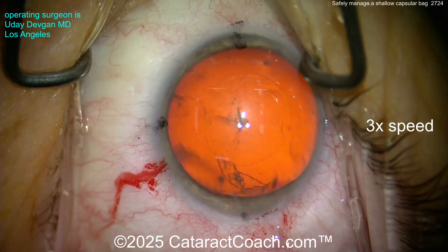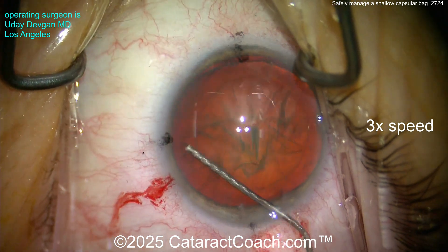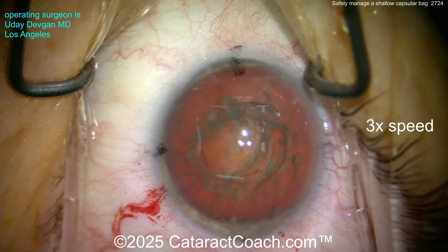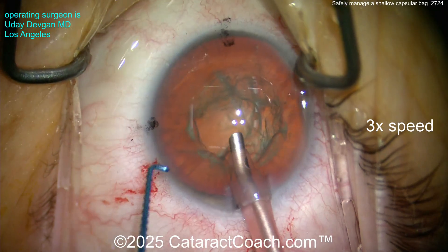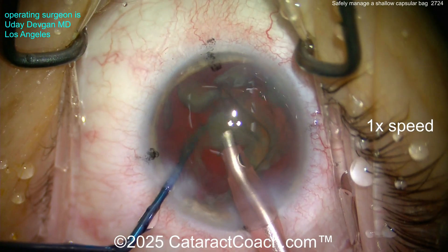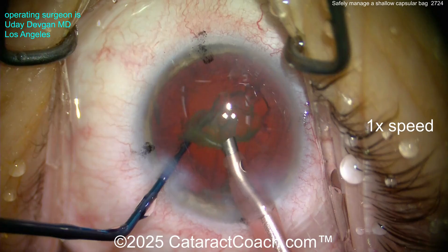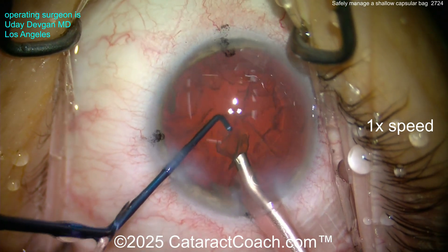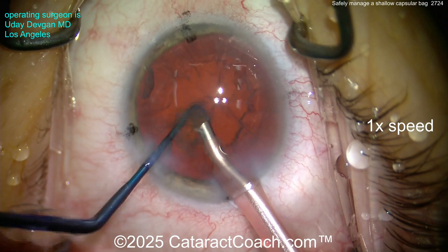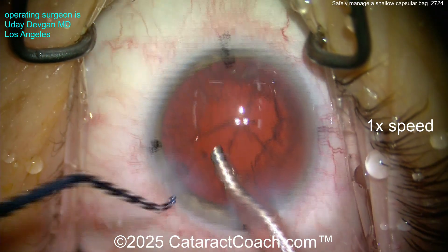We sped the video up to get through it quickly. I got a good rhexis done; this part's pretty routine. I'll get the lens — we're going to chop it, leave it in the bag. Chopping in half, splitting the pieces. Now getting the last bit of cataract out of the bag. Watch carefully — as I get the last piece out, look at the posterior capsule.